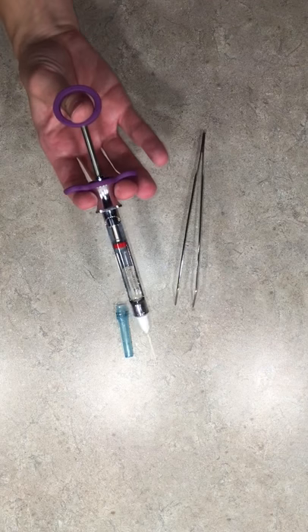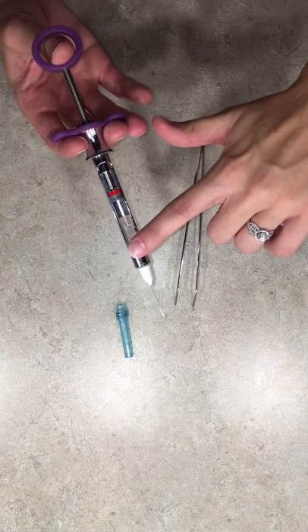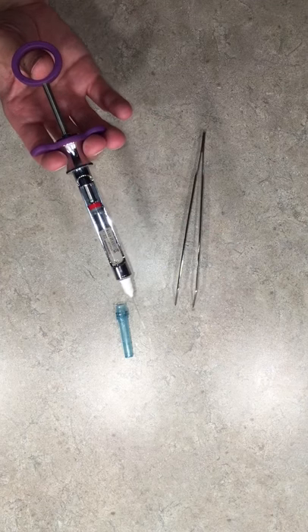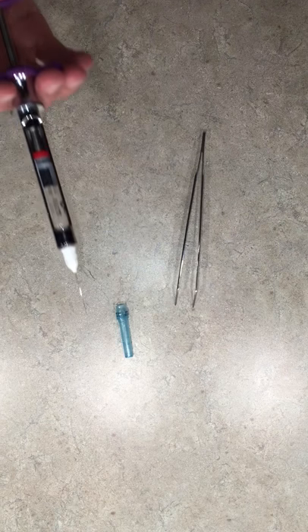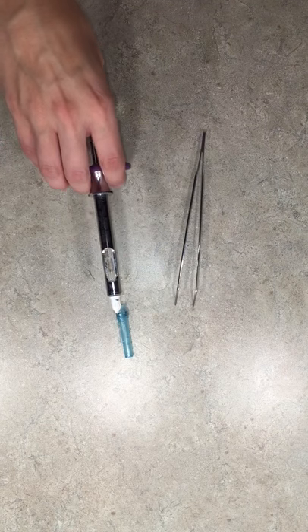We would come palm side up — you can clearly see that cartridge there — as if we're mimicking that we are going to give an injection. We would give our injection to our patient, and when we come back, I'll flip palm side down.